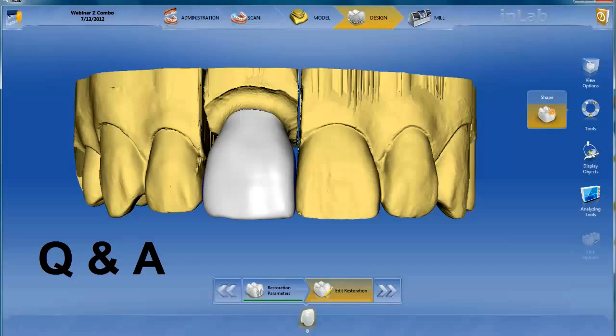Does it matter which order I scan the images into the catalog? Can I do the working model first and then the biocopy? Really, the system does not care which order they're scanned. When I do them, I do the biocopy and the working model first. It usually defaults to the biocopy, but I'll do those two first.